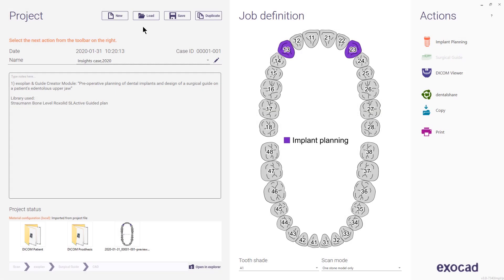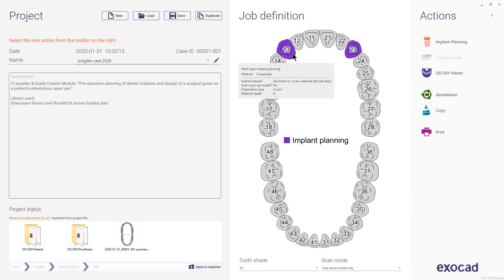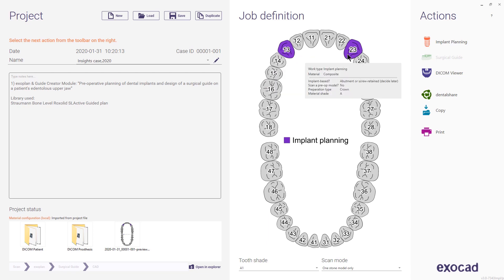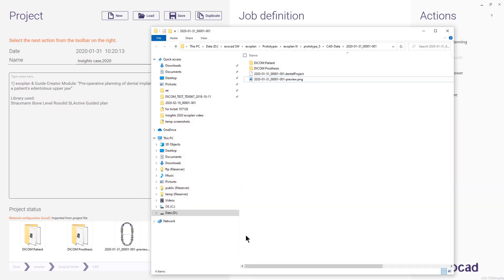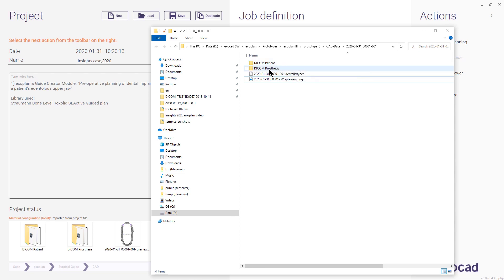Hello everyone and welcome to this Exoplan session for Insights. For our case today, which is an edentulous upper jaw case, I will place two implants using the dual scan protocol and thereafter design a surgical guide. In the Exoplan DB, I have defined tooth 1-3 and 2-3 as work type implant planning and selected implant type, abutment or screw retain decided later. Since I'll use the dual scan protocol, I have a CBCT scan of the patient wearing a prosthesis with radiopaque markers, and a CBCT scan of the prosthesis alone.